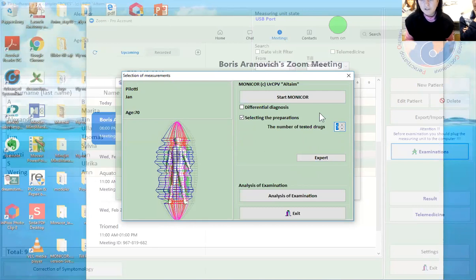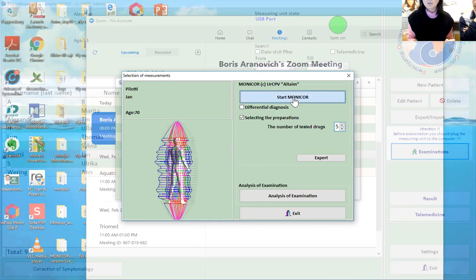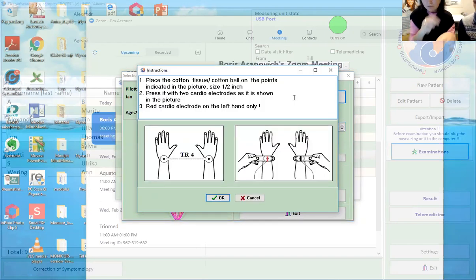After you start, you put it in the hand on the other side, like it shows here. You see? Not on the MC7, but on the other side of the hand. And press OK. First it will scan, then it will tell you to put the first pill on this one, aluminium, this one. Can you see? Yes, I can see. So you put the first pill here and press OK.